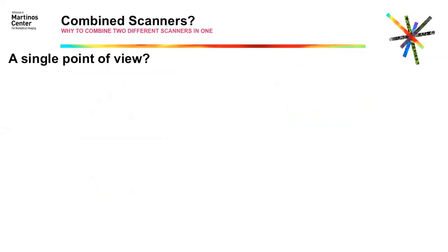So, as we were saying, PET scanners are now combined with CTs most of the time, but in our center we don't do the CT, and I will explain to you why. Well, one reason is because PET imaging is lower resolution, and we want to have a matching high resolution imaging technique. CT is very good on that, and it's also providing the anatomical images behind the functional from the PET. Yes, so CT is an anatomical imaging technique like MRI.